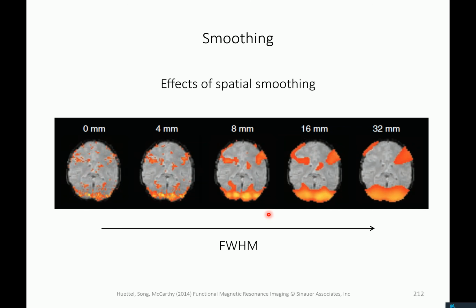If you do this with a broader filter window, of course you will take more data from adjacent sites into the data point that you allocate to a given site. So you have a running average, and the running average just takes data from more sites. But this is filter theory. The width which you take is like the standard deviation of a certain kind of Gaussian.